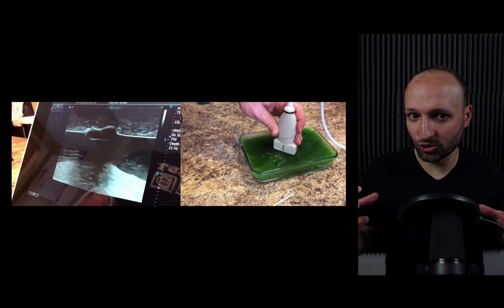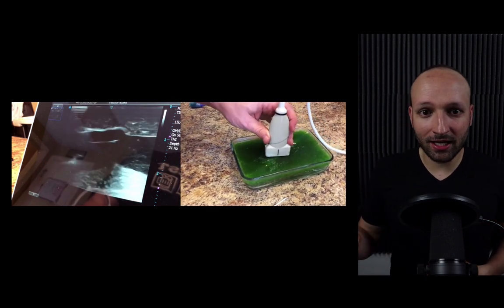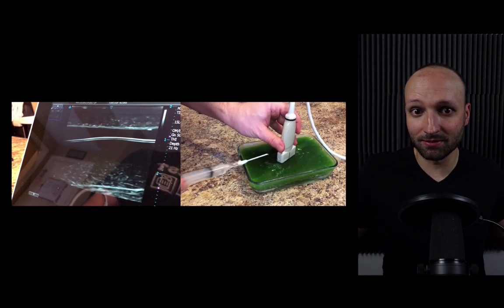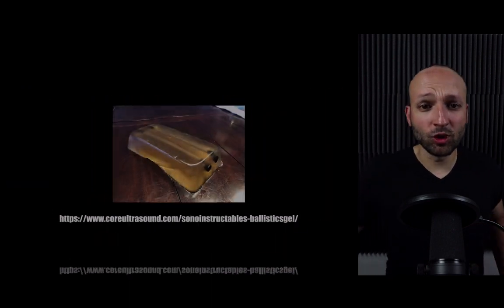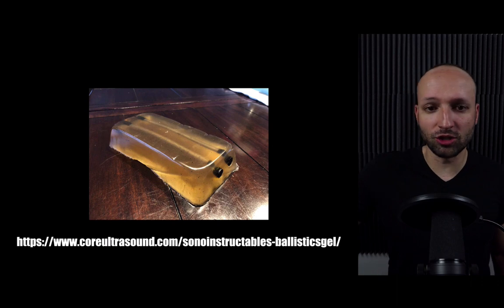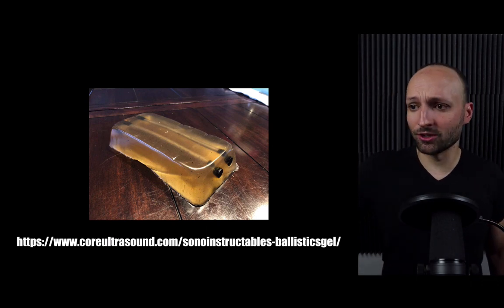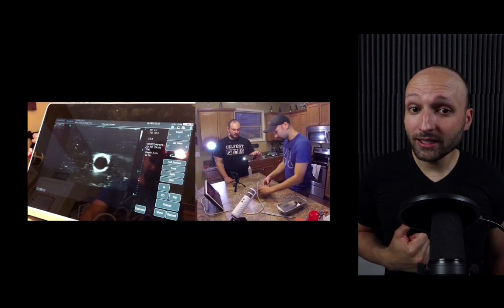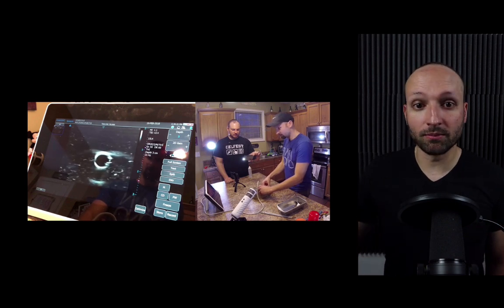We're using a Penrose drain in this instance, which is something that you can just get from your hospital. It looks maybe not 100% as good as the Blue Phantom, but it's much cheaper, much more accessible, and it's a good way to practice. You can also create a ballistics gel simulator, which there's the URL for that. We have tutorials on how to create that as well. These also look pretty close to what we see with the commercial simulators.